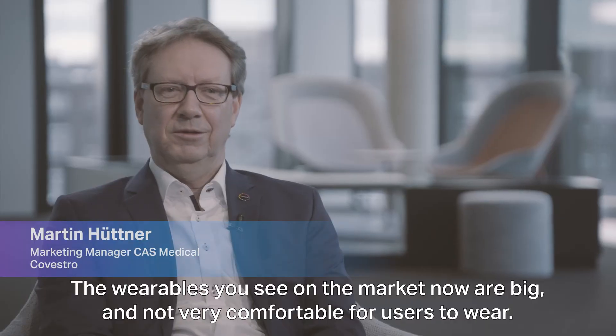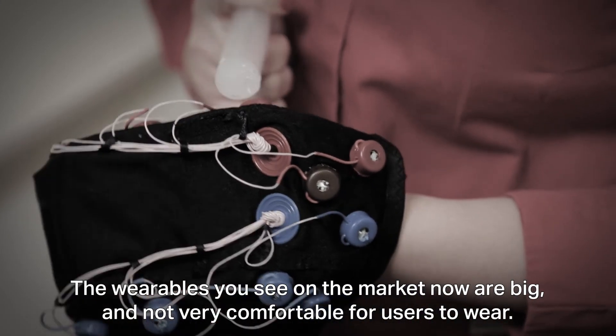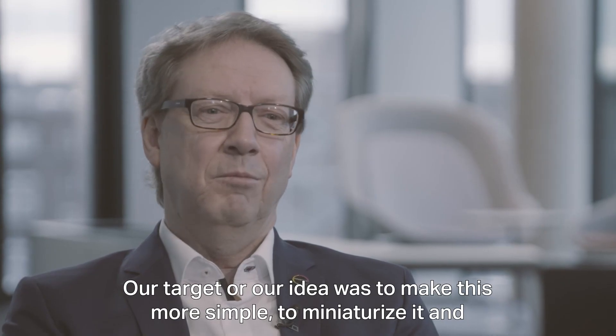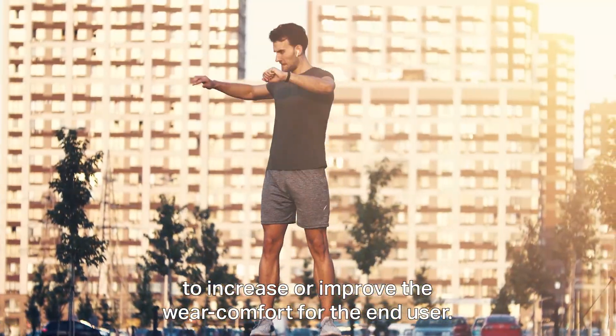What you see on the market now is big, it's not very comfortable for the user to wear. Our target, our idea, was to make this more simple, to miniaturize it and to increase or improve the wear comfort for the user at the end.